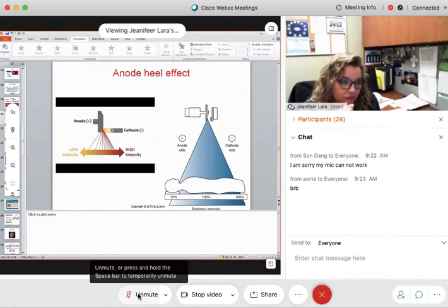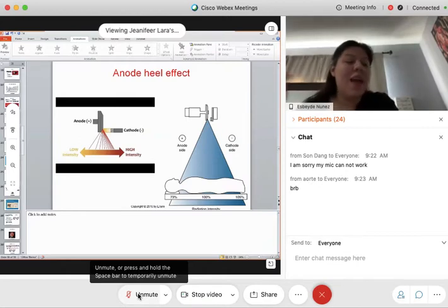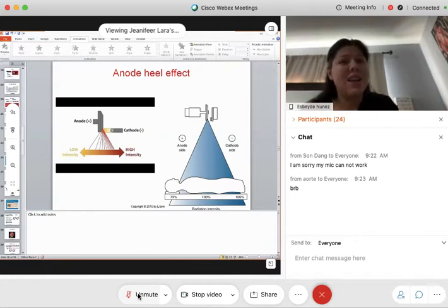Ms. Zara, I just want to verify if I understand right. On the track analogy, the focal track is made of tungsten, which has rhenium, and then molybdenum is in it, so it doesn't melt as fast. And then the last coat will be like graphite.